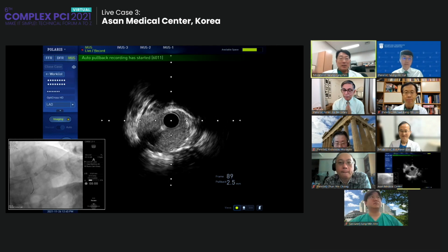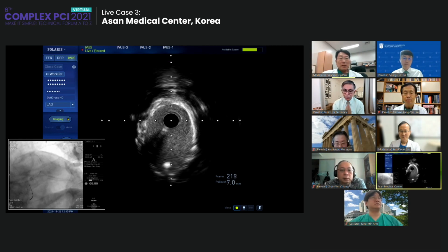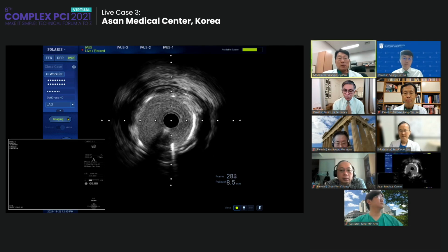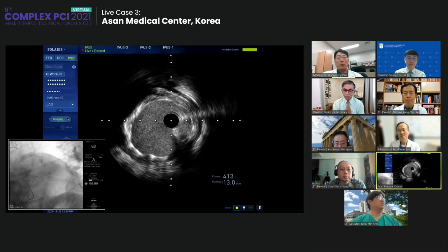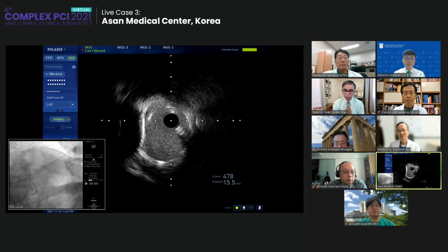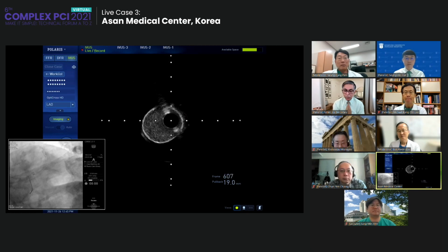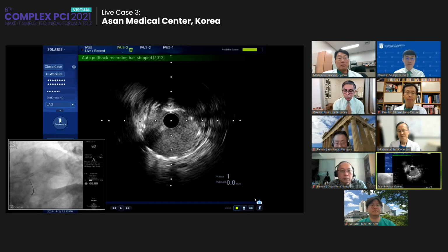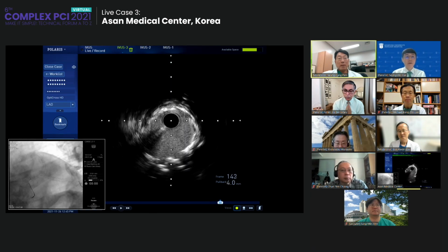All right. Okay. So that is basically diffuse disease. Yeah. This is the circumflex, right. It is coming. Yeah. Good. Fixation is good. The proximal part, I think, is quite enough. Yeah. Quite enough. The left main, right? Is quite enough. And in the main, slightly one or two struts are protruded into the circumflex. Yeah, great. And then we're going to check the final angio.